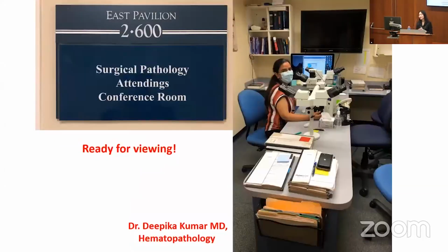This is my colleague, Dr. Deepika Kumar, who I trained as my fellow a few years ago, and she is now my colleague. So she is actually sitting here. This is around 9:30 when all of these trays of slides have arrived. And this is the initial interpretation of the H&E, the hematoxylin eosin stain.